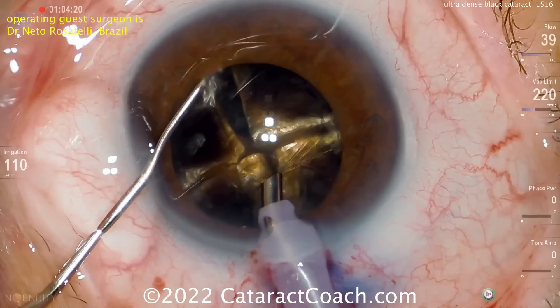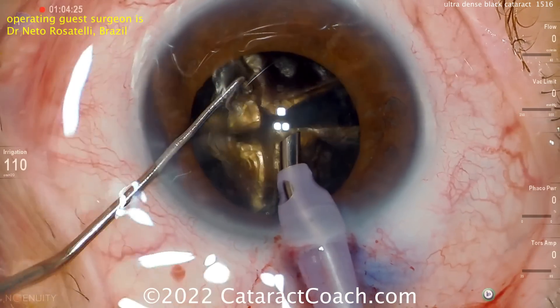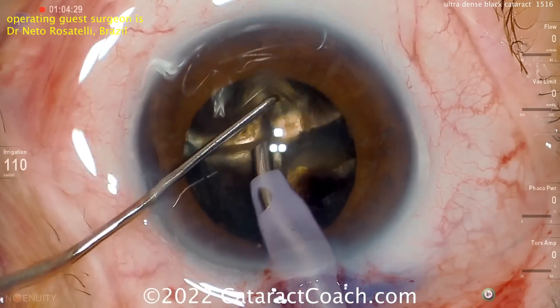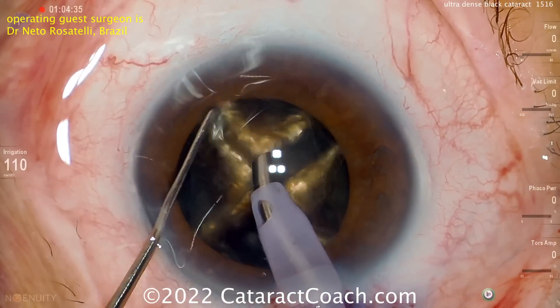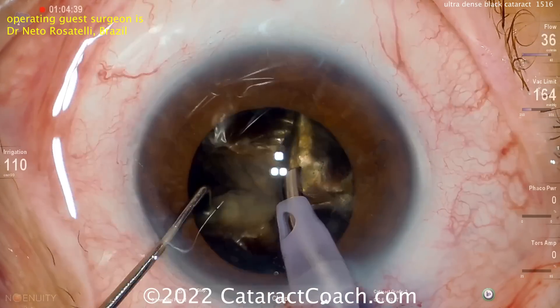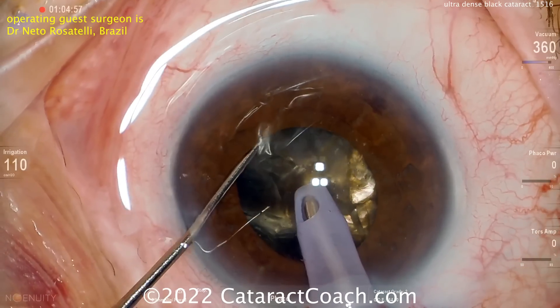Now that you have four quadrants, each quadrant can be removed. Switching over to a different chopper and rotating around — the pieces are nicely freed up, four big dense pieces. Now if you're not so skilled in this and you're more of a beginning surgeon, this case would be great for MSICS — manual small incision cataract surgery — where you extract the nucleus whole.